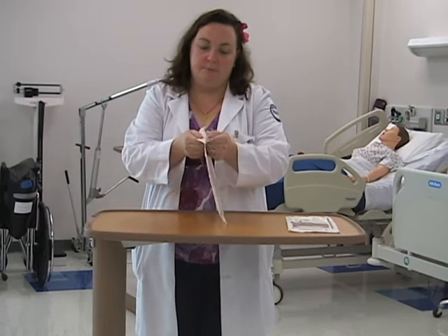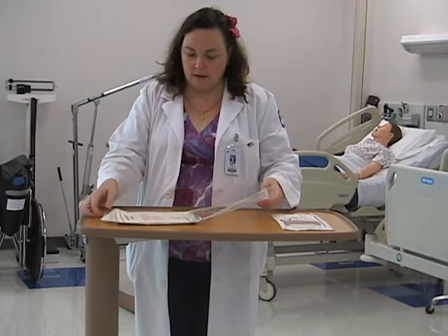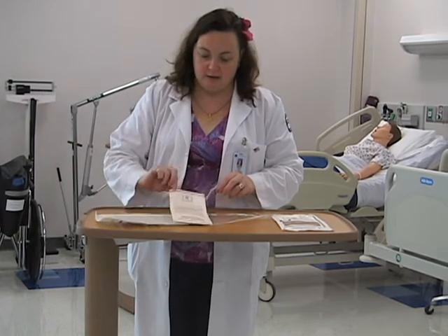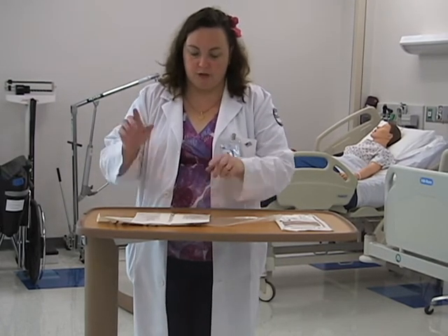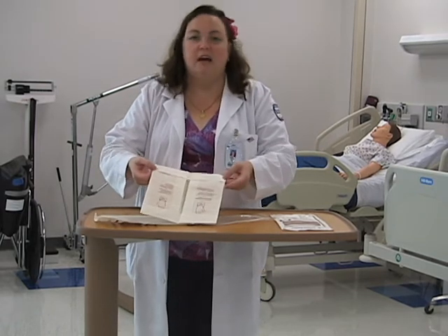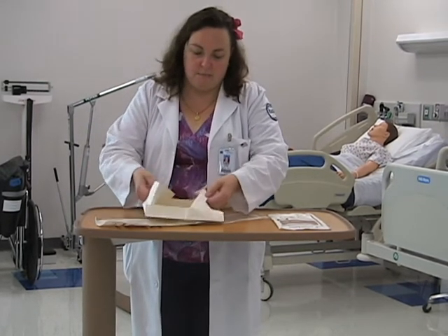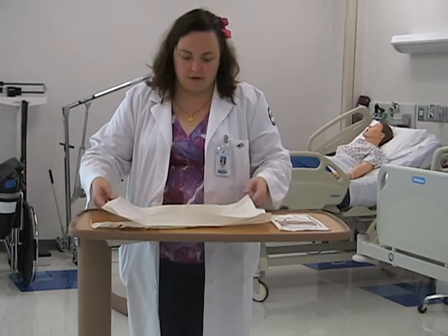So you open it up from the top. Inside the glove is sterile. You're going to take your glove and put it with the number facing you, and you're going to open it up. When you look at the glove, you're going to see it says left and right. Take your fingers, put them into the pink envelope, and you're going to open it up — and there you see two gloves.